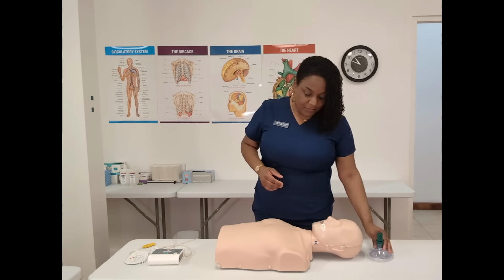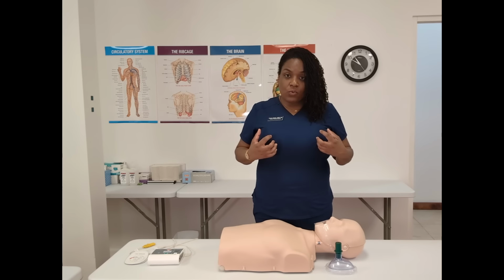And men, if you feel uncomfortable exposing a woman's chest, the Good Samaritan law is going to protect you if you are rendering aid. If you still feel uncomfortable and you have 911 on the phone, you've called for help, we want you to start those chest compressions on top of clothing. But if you do realize and you're really trying to save this person's life, the reason why we expose the chest is in preparation for the AED. And so we do want you to do something. And there is a healthy fear of, maybe lawsuit or litigation because you exposed a woman's chest.